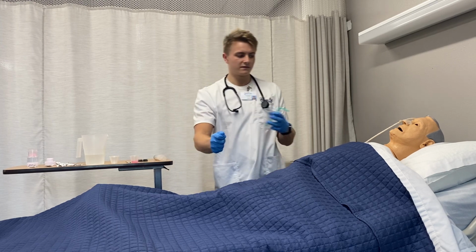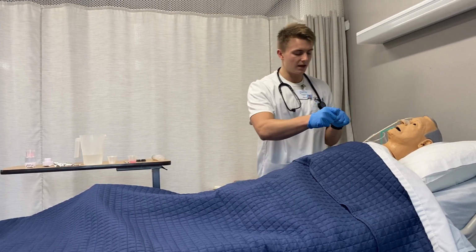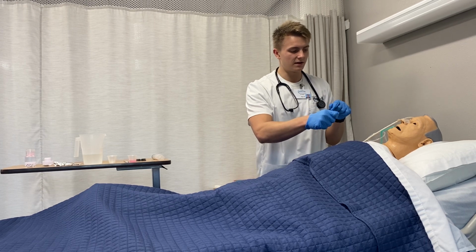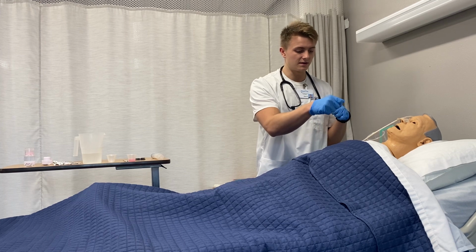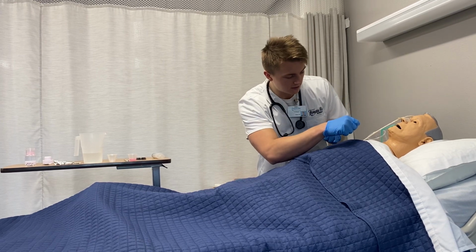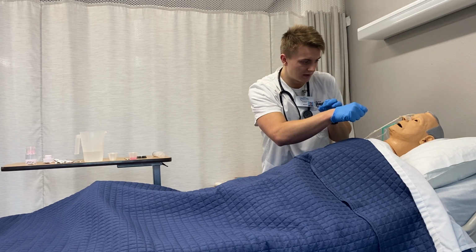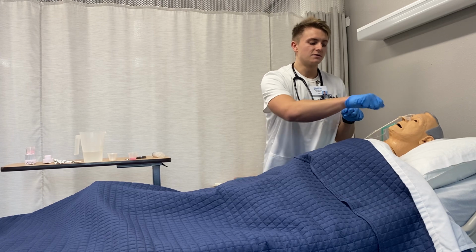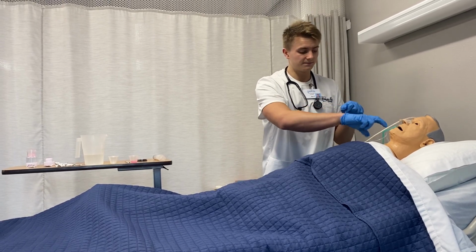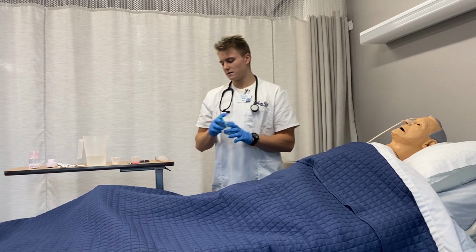And I'm going to give Jim some water, and I'm going to instruct Jim to sip on that water. And every time he sips, I'm going to insert the tube. So I'm going to make sure that I have the tube going down the appropriate naris, which is going to be the bigger of the two. So every time he sips, I'm going to insert it until there's no insertion, there's nothing left, or it's to the point where I had previously indicated.